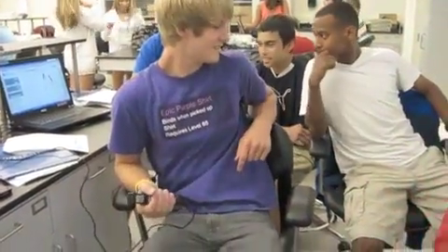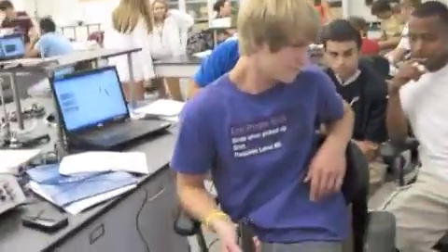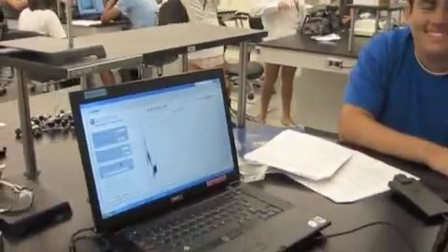And then now he's not going to look at the screen, so turn around. Okay, and then if you look at the computer screen, you'll be able to see the difference. No, it's gone. It's gone. Oh. Okay.